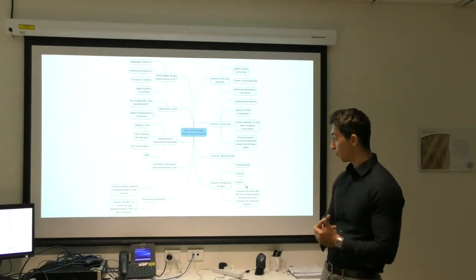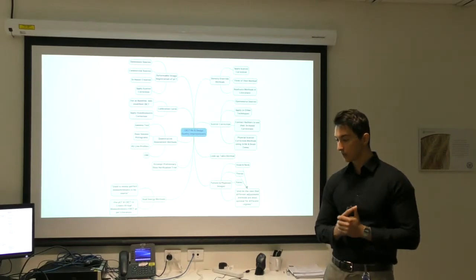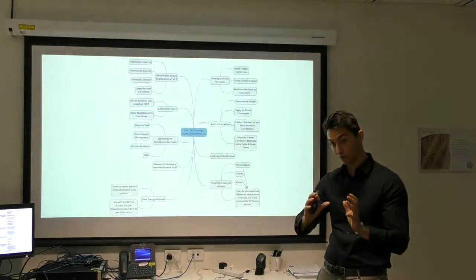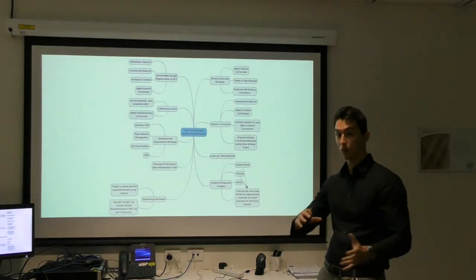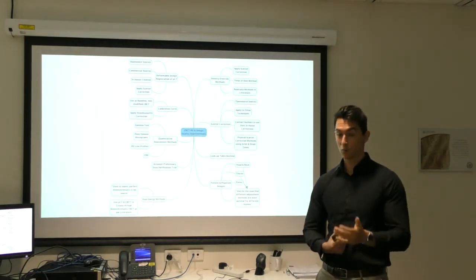So I think the most promising method is actually deformable image registration. So you deform the planning CT with the contours to the CBCT, and that automatically deforms all of the contours, so that saves a lot of time. And that's one massive hurdle.